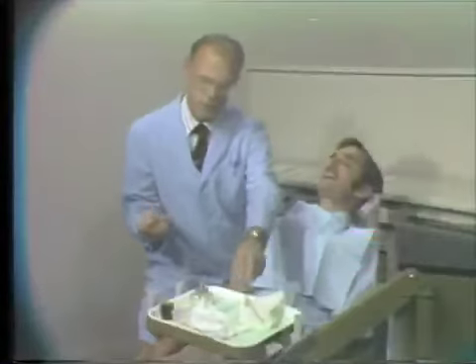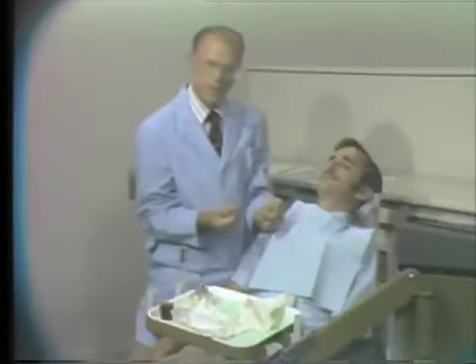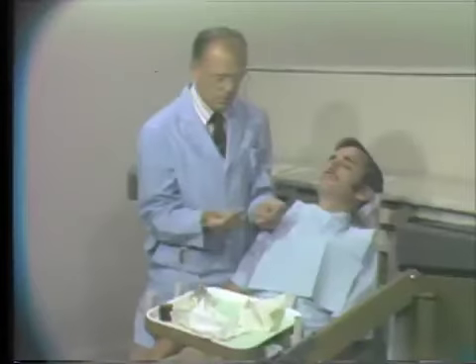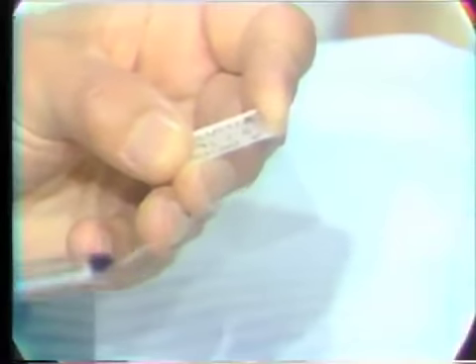Having done this, we will pick up the slide which has on it the patient's name, date, and the registration number of the patient or other identification number. Then we will smear the material evenly over the surface of the slide.